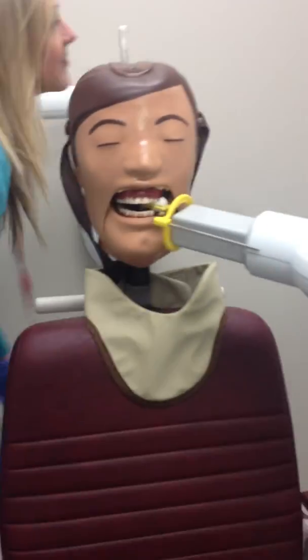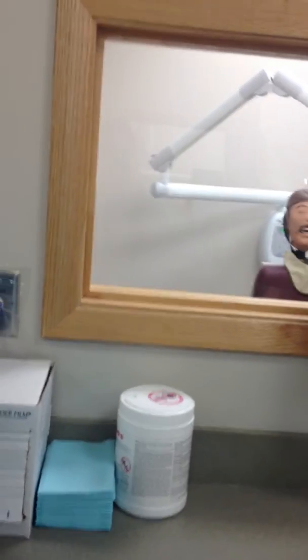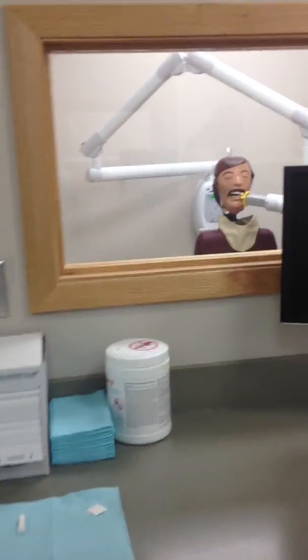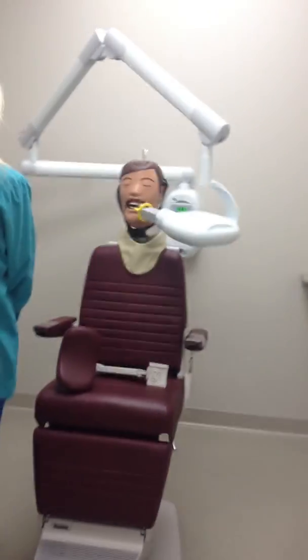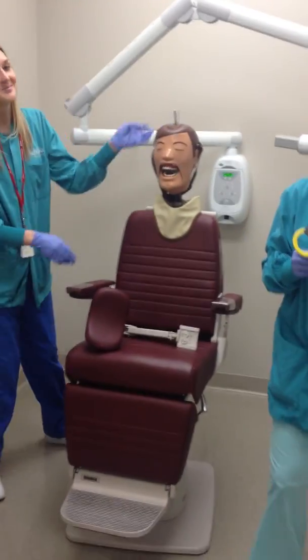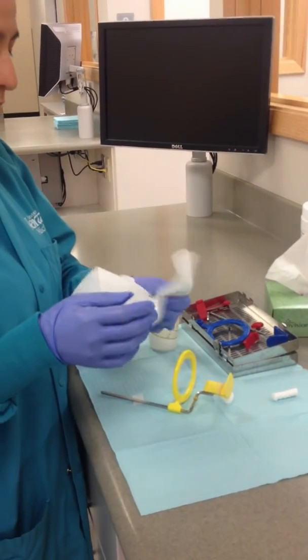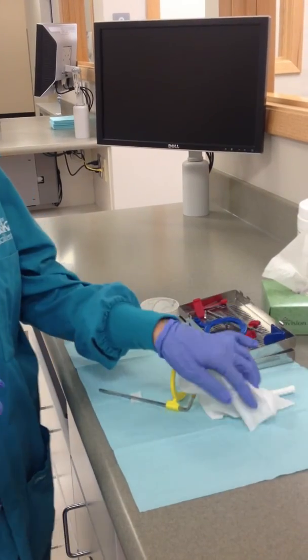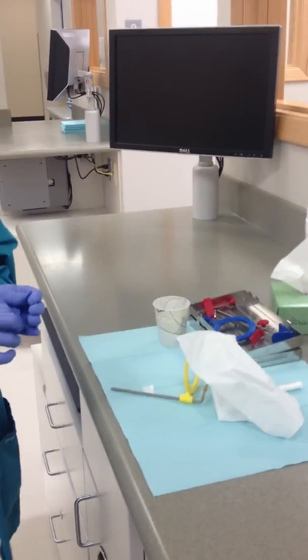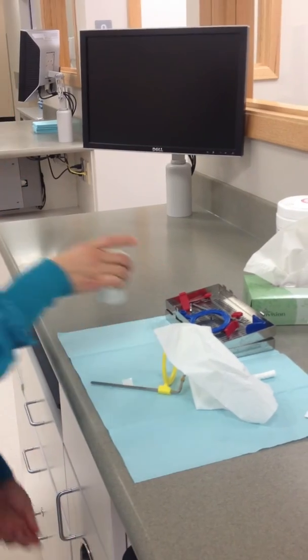Step outside the x-ray room. While watching your patient through the glass, press down on the exposure switch until the beeping sound stops. Remove the XCP from the patient's mouth and bring to the counter. Take the film out of the bite block and wipe with a Kleenex. Place the film in the Dixie cup. Remove gloves to transport the Dixie cup to the dark room for scanning, mounting, and interpretation. Make sure to clean up your unit when finished.